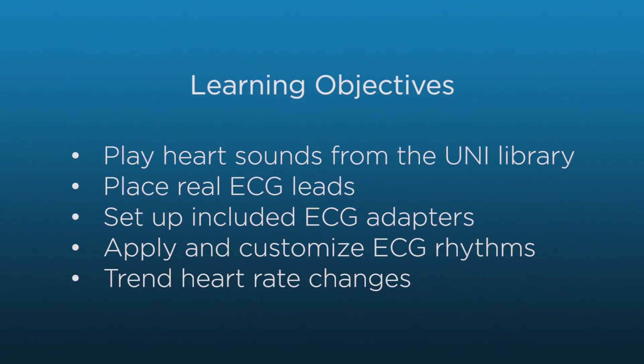By the end of the video, you will be able to select different heart sounds from the pre-programmed library, place real ECG leads for picking up rhythms, set up the included adapters to accommodate disposable ECG leads, apply and customize rhythms from the Uni library, and trend changes to the heart rate.